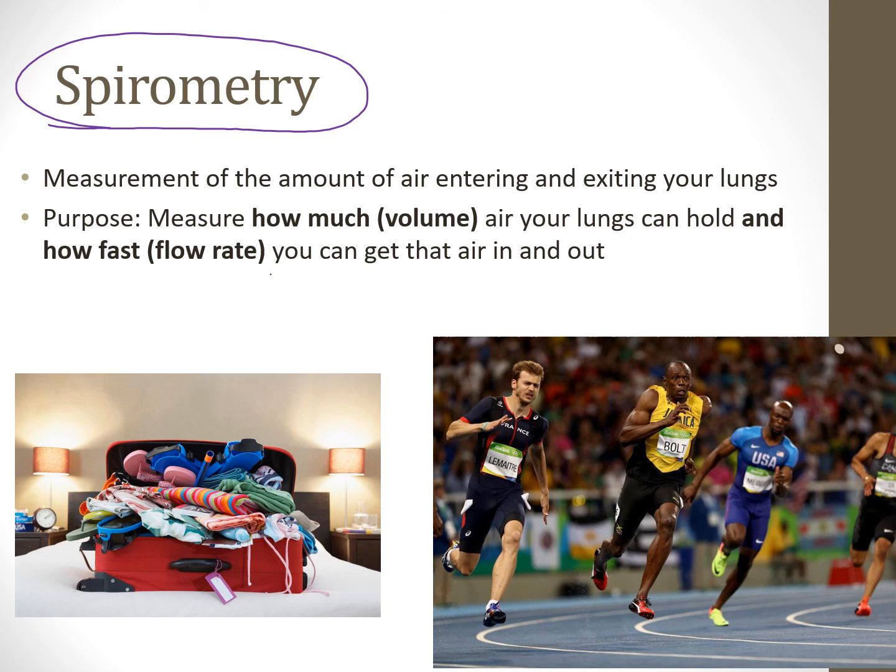So they just want to see two things. I want to see volume, how much volume the lungs can hold, and I want to see how fast the gas flow is, right? So I want to see volume over here, which would be restrictive effect. And then over here, I want to see how fast it goes, which would be obstructive effect, right? So like asthma, emphysema, and over here, restrictive, it would be like pneumonia, right? So how fast it goes, that would be your flow rates, like obstructive disorders, or how much volume or capacity it has would be restrictive disorders.